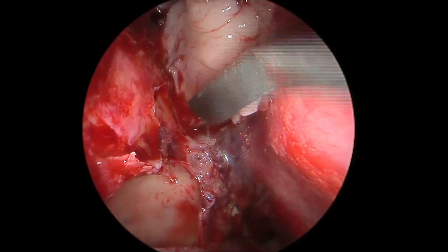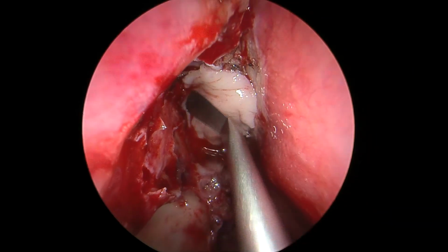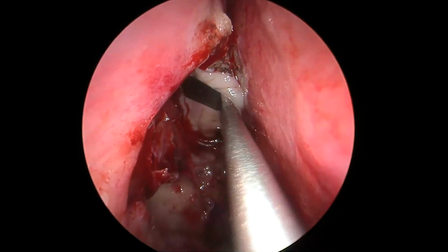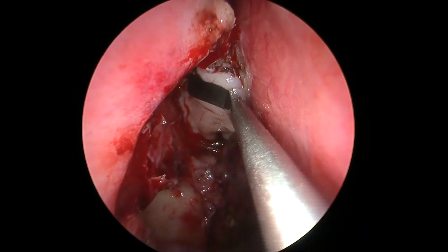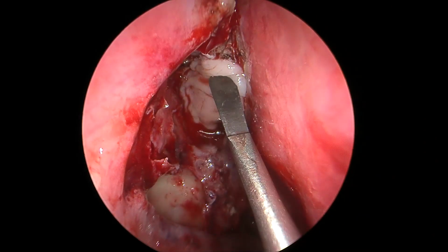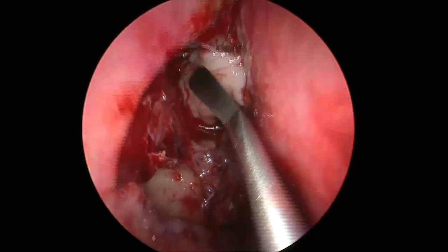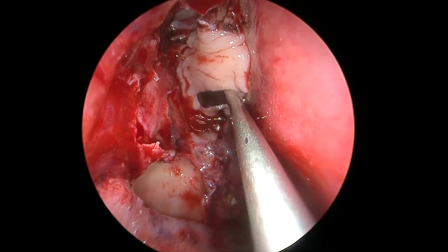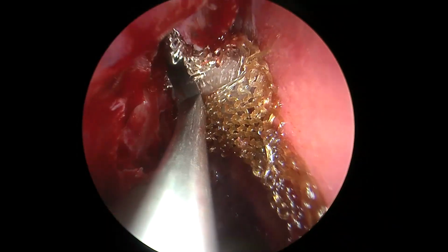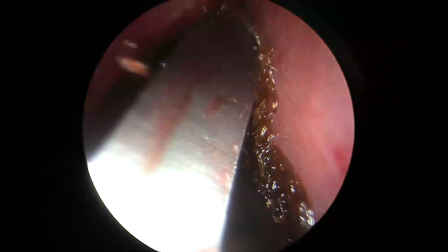The middle turbinate seems like a natural choice because it offers us a good exposure post resection of the middle turbinate, and the entire mucosa, if elevated appropriately and correctly, can give a reasonably sized graft for us in all these patients. Now you see, once we use the middle turbinate mucosal graft, almost the entire bone that we ablated is very well covered with this free mucosal graft, over which we'll just use a little bit of Surgicel in the end to secure it nicely.